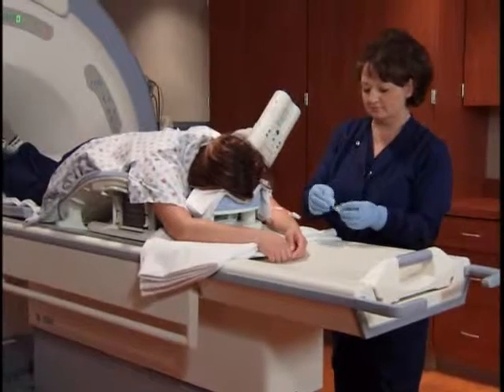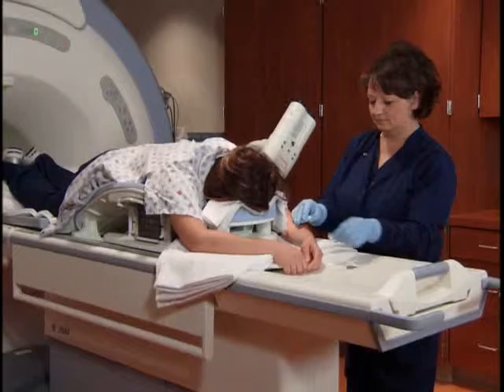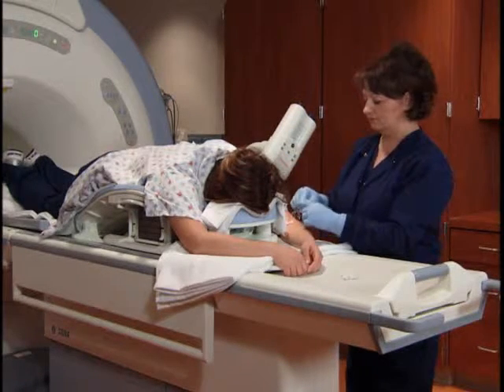We stress that should they feel the breast has moved, possibly due to a sneeze or a muscle twitch, please let us know if we have not already seen it. We can likely replan the procedure rather than proceed and miss the lesion.